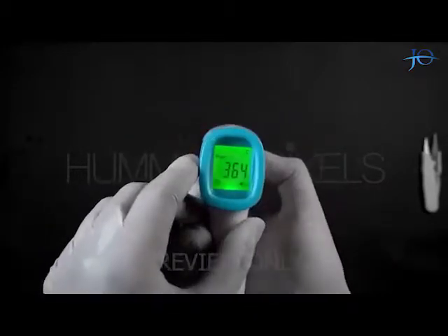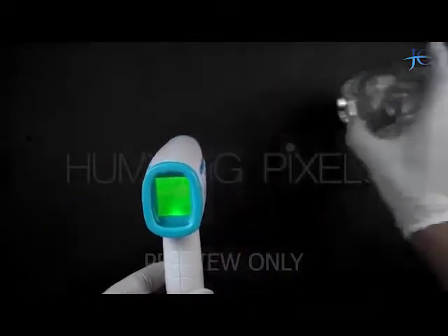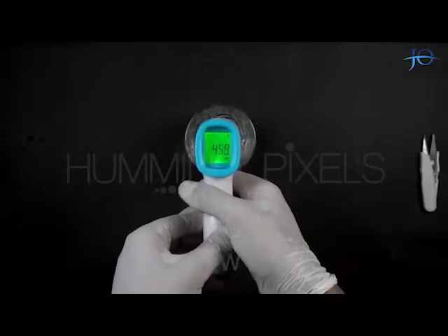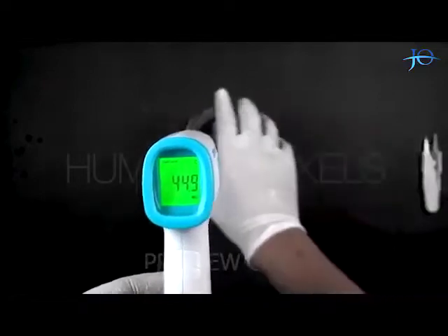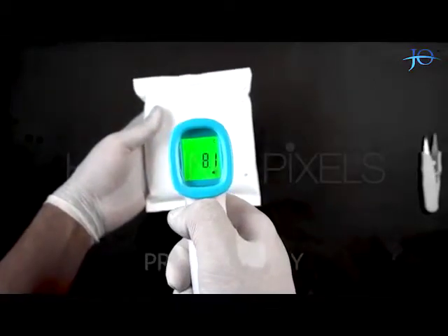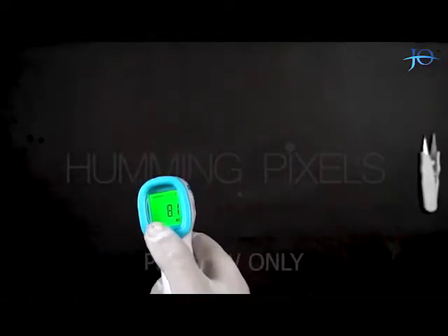Let's get started with surface mode and see how it works. Here we have a glass of hot water — we point the sensor towards it and press the trigger button. We can see that the screen is now indicating the temperature of that surface. Now let's try it again with a pack of ice using the same process. The reading of the cold surface on our screen is 8.1 degrees Celsius.